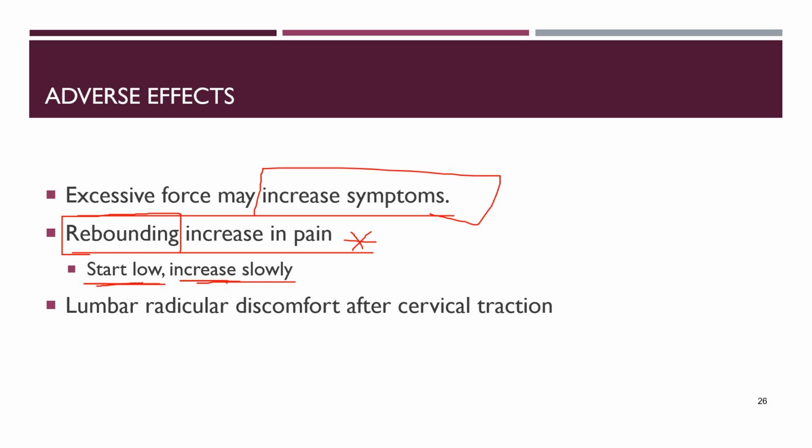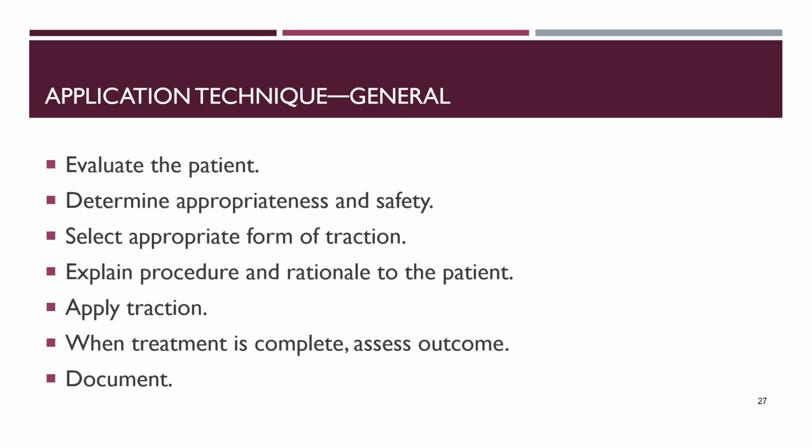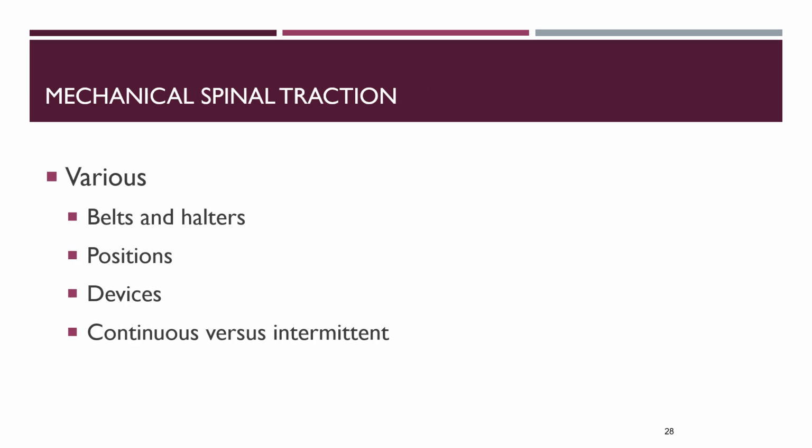And there just may be lumbar radicular discomfort after cervical traction. So their pain may increase because of this rebounding just after applying traction. So we're going to skip past this part here.